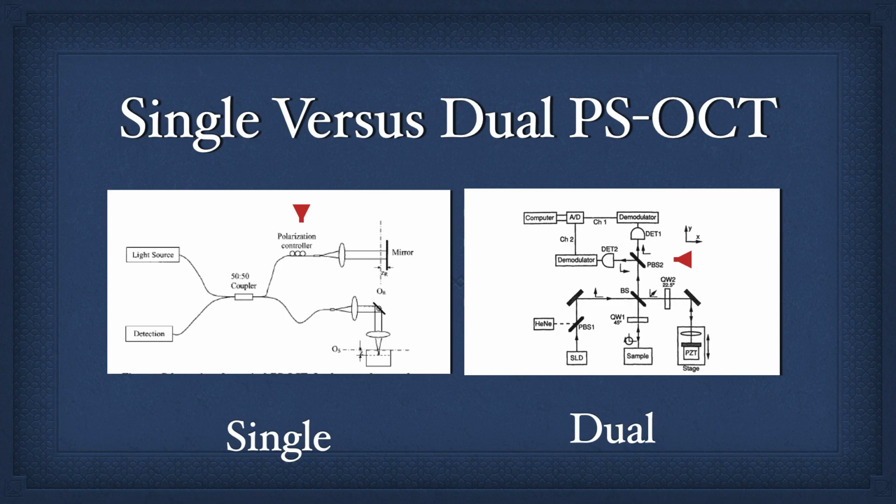So what we do is we add polarization paddles to the system, which alter the polarization state. It can be viewed of the incident light. And as we saw, if the tissue is highly birefringent, it has banding patterns, and we don't even have to bother moving those paddles. In the artery, where you have far less collagen, you do have to rotate the polarization state.